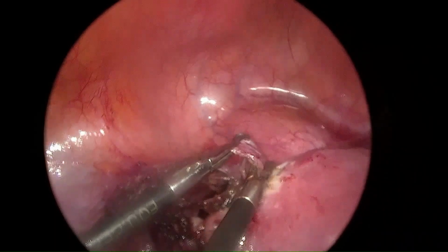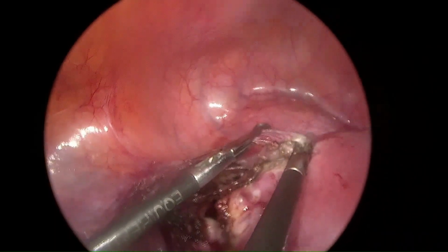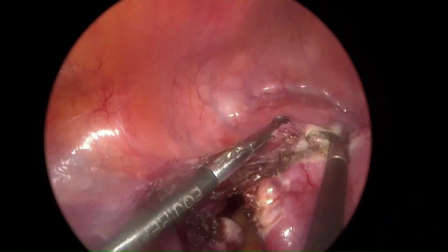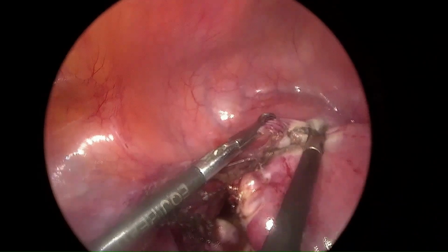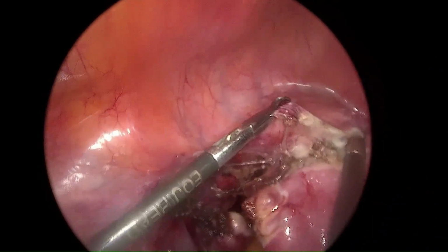Medial to the medial umbilical ligament, beneath the UV fold of peritoneum, there can be adherent bladder. So, cutting the UV fold of peritoneum from here onwards must be done carefully, just to involve only the peritoneum and not the bladder underneath.